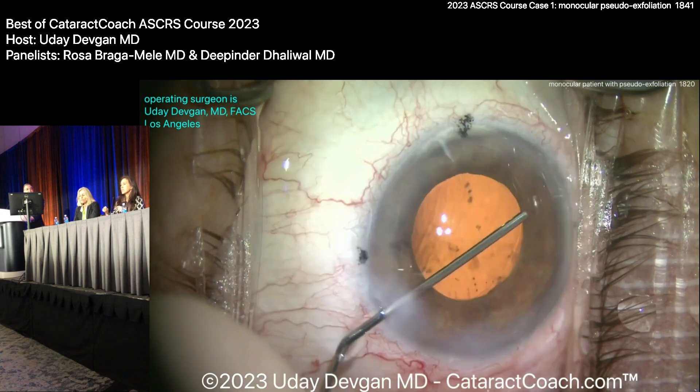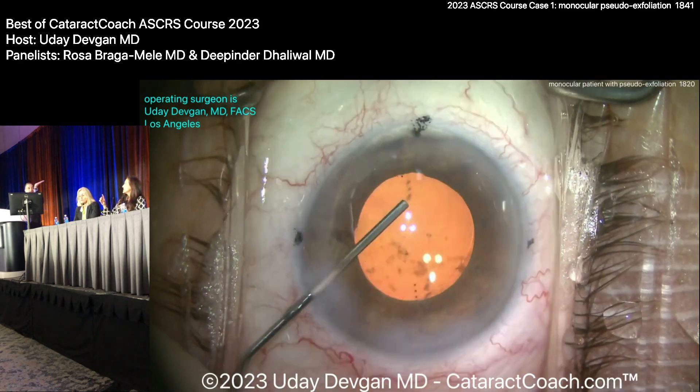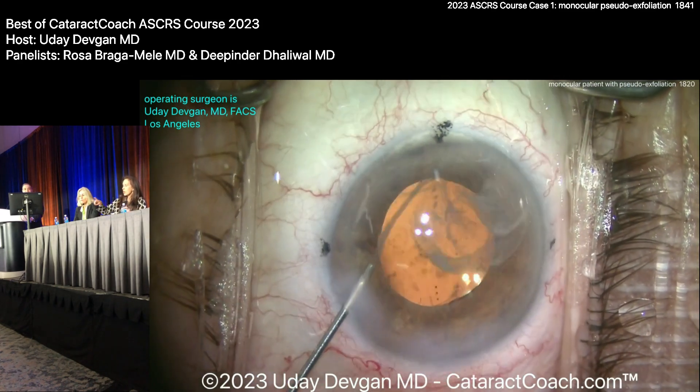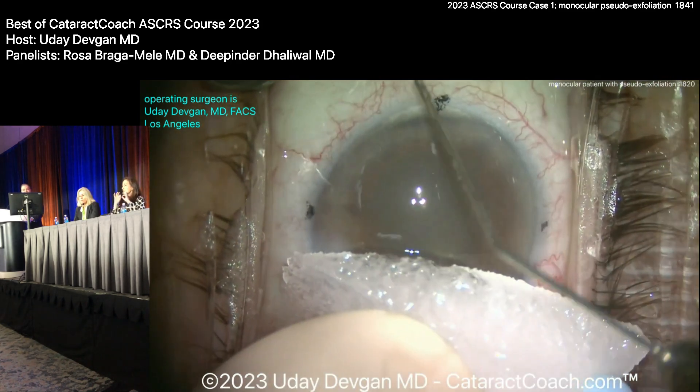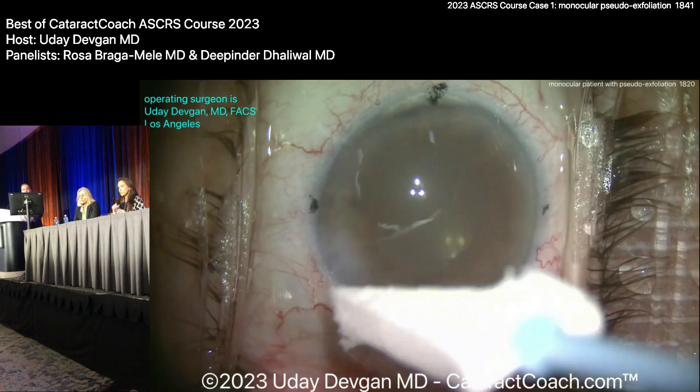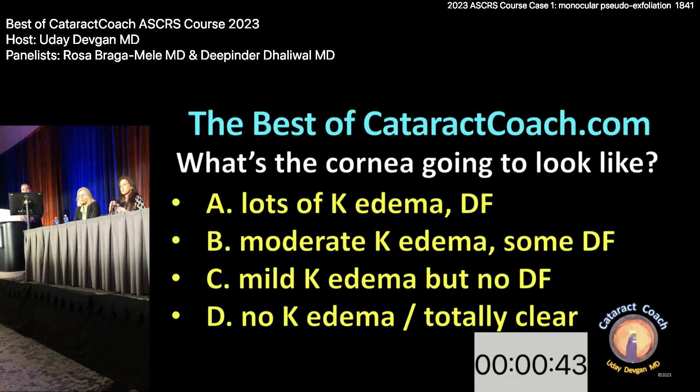You start it all the way to the left, it comes out following the capsule — it just hugs the capsule and is beautifully gentle. Now after all that, I put some triamcinolone in low to help quiet it down. So what's it going to look like tomorrow, cornea gurus? Is that a lot of corneal edema? Moderate, mild, no corneal edema, or totally clear?